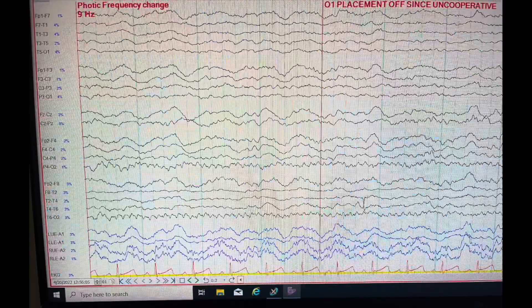I'll show you a picture of the EEG of what I saw — I was like, hmm, this is peculiar, why are we seeing asymmetric photic driving? Well, some reasons for an actual abnormality would be, for example, if they had a tumor just on one side of the back of the head, it could be causing asymmetric photic driving. That's why if doctors see this abnormal response they're going to want to order tests like a CT of the head or an MRI to see what is going on and causing this asymmetry.